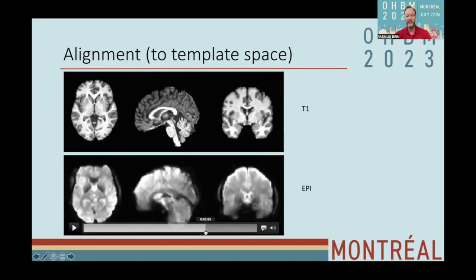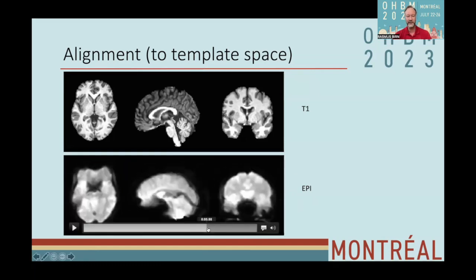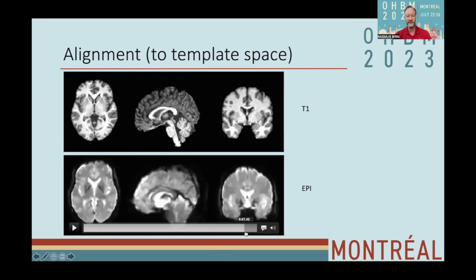You also notice here a little bit of an odd one. This looks like it's upside down. And this was actually an error in how the image was converted into the NIfTI file. So there was an error in that header information. So we can flag these potential problems.